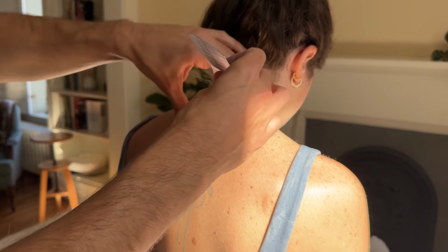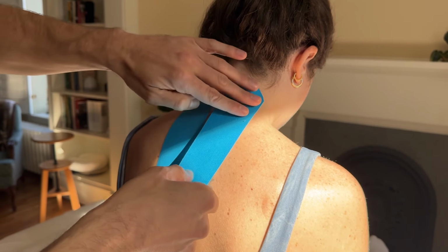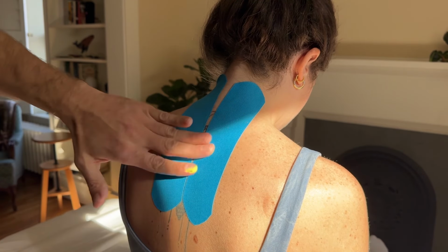As you create the anchor point, you can pull the tape, and then that will allow the paper to break off the tape a little bit easier. And then right beside the spine in the erectors on the other side, you're going to lay the tape down.